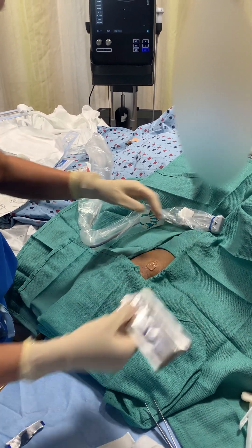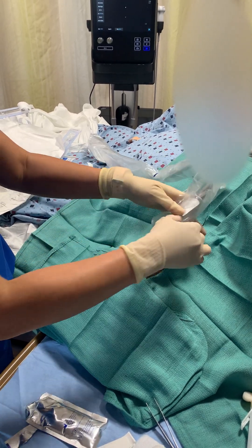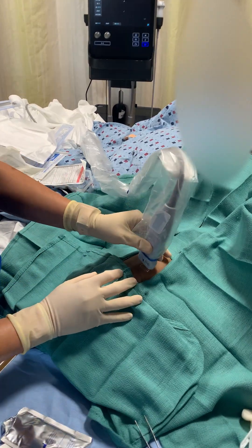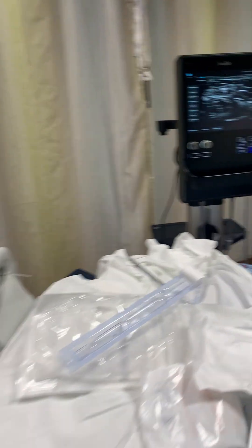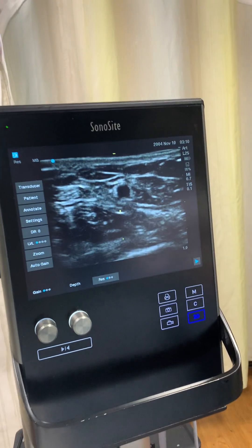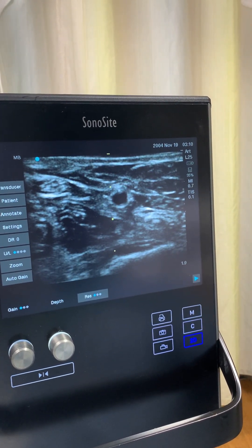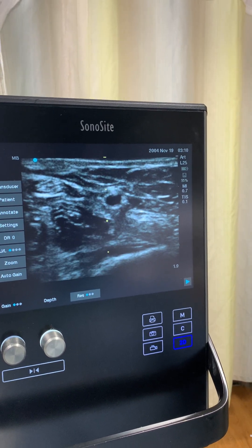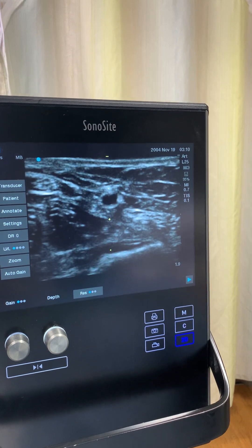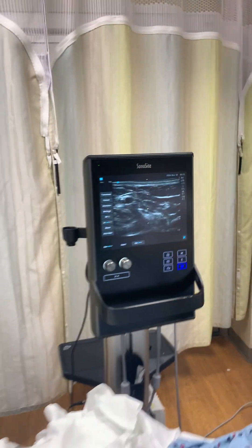You see that pulsating. And when you press, you can't really collapse the vessel — it's not collapsible. It's pulsating. So that's how you would know it's not a vein — it's an artery. Press again — it's still not collapsing. We got a good target.